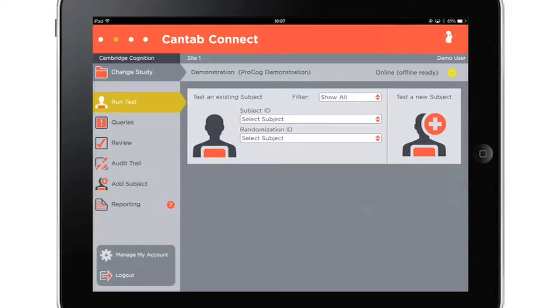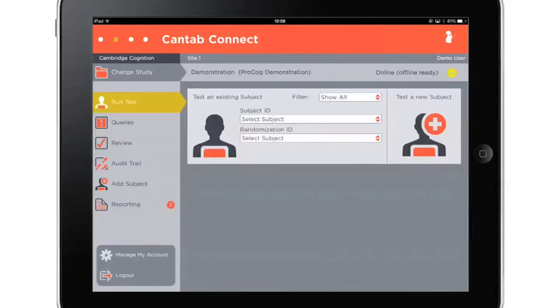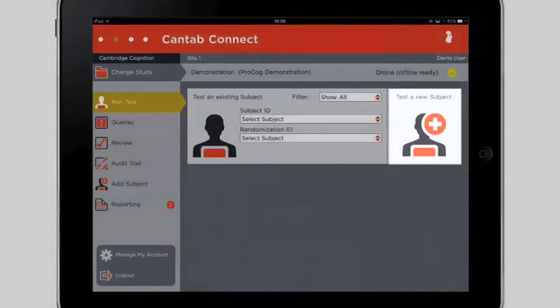It is now quicker and easier than ever to add subjects and collect data using Cantab Connect for clinical trials. Subject details can be entered ahead of testing, and they are then selected from the drop-down list here. Alternatively, add the details of a subject at the time of testing by selecting Test a New Subject here.